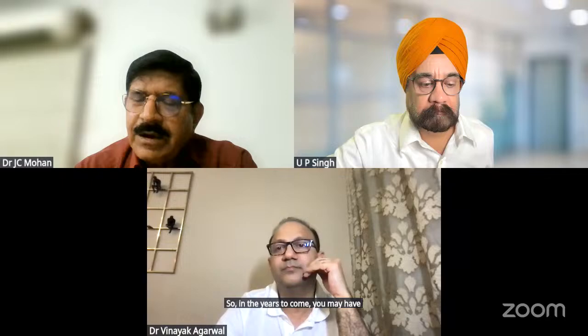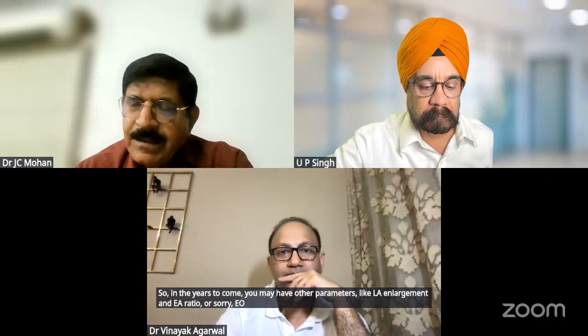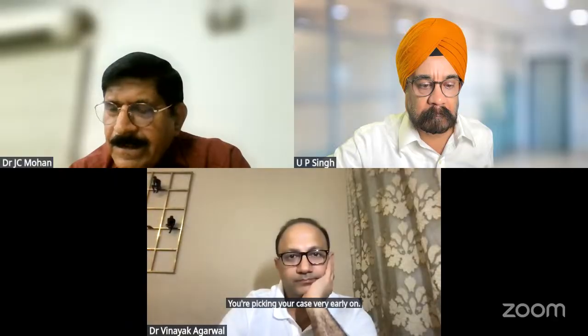So in the years to come, he may have other parameters like LA enlargement, E/A ratio, E/E prime ratio, and reduced E prime as well. You're picking up your case very early on for diastolic function only.